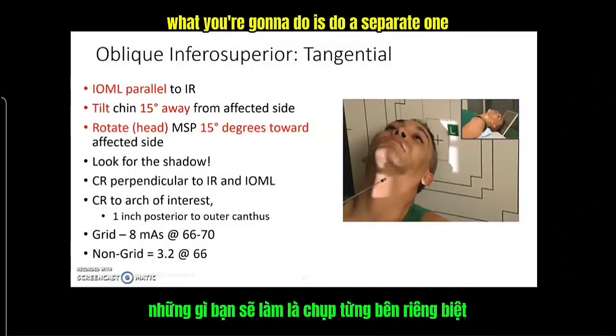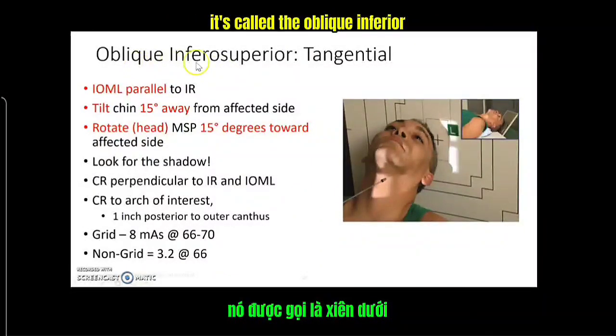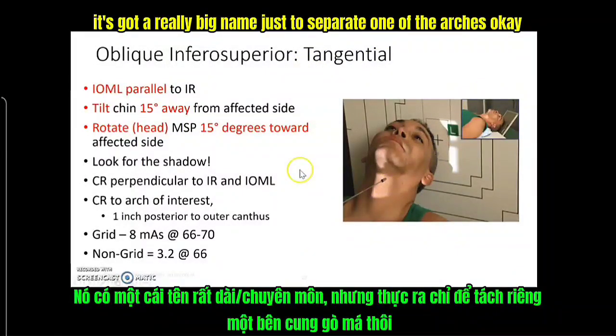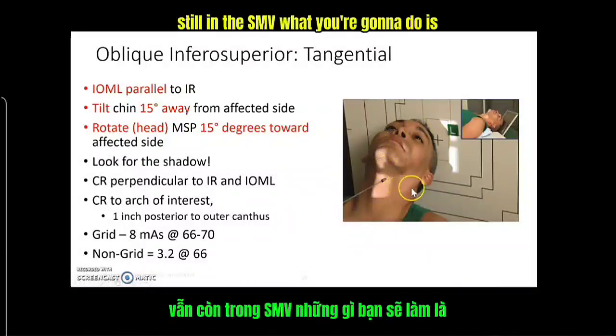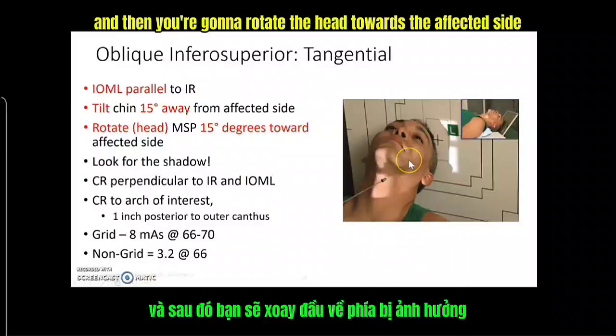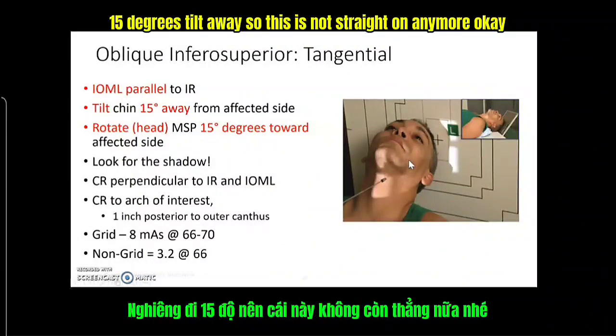So if you cannot visualize one of the zygomatic arches on your SMV, what you're going to do is do a separate one. It's called an oblique inferosuperior tangential projection of the zygomatic arch. It's got a really big name just to separate one of the arches, okay? Still in the SMV, you're going to tilt their head 15 degrees away from the affected side, and then you're going to rotate the head towards the affected side 15 degrees.